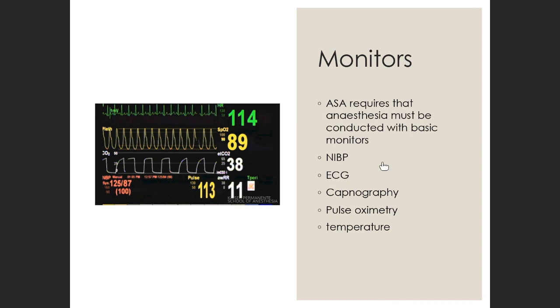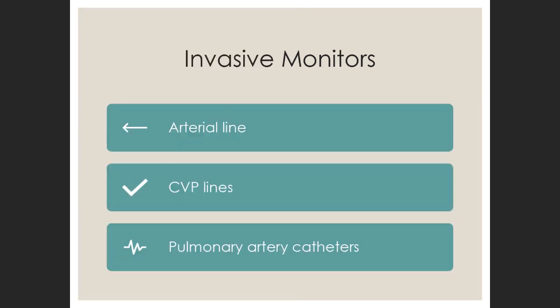All right. So there are some basic monitors in addition to the anesthetist that the American Society of Anesthesiologists has put out: non-invasive blood pressure, ECG, capnography, pulse oximetry, and temperature. We don't always do temperature, but it is recommended.